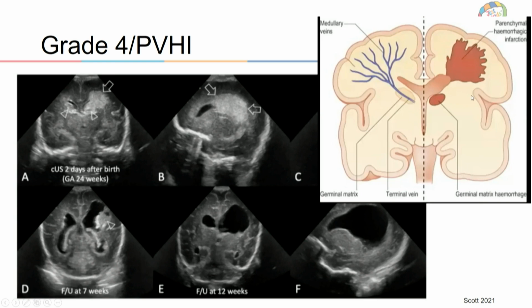and you have a hemorrhagic infarction. And so you can then develop a porencephalic cyst, is what it's called, once you have that infarction, and it's that fan shape, so that should be a tip-off. And you can see it's hyperechoic, right? It's about as hyperechoic as the choroid again, and so that should tip you off that it is pathologic.